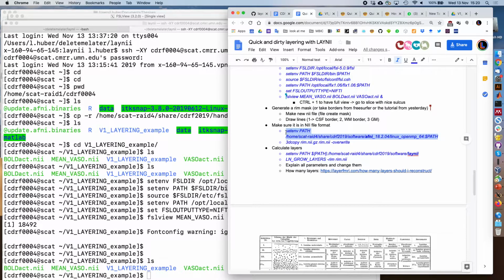I never worried about that because I never had these weird issues. I didn't test it, and that's why I couldn't use it. I checked out your C++ code, and it seems like it should be reasonably possible with minor changes. It should be absolutely straightforwardly possible. Sorry, please go on.